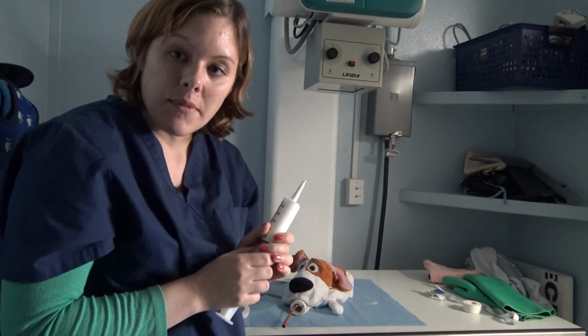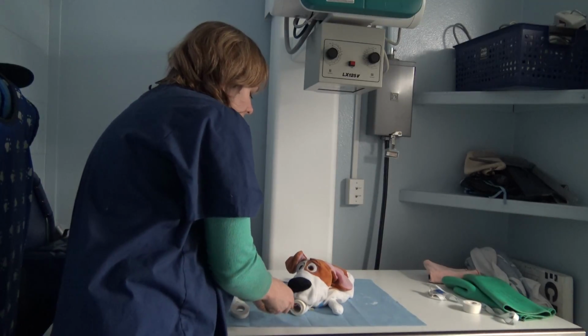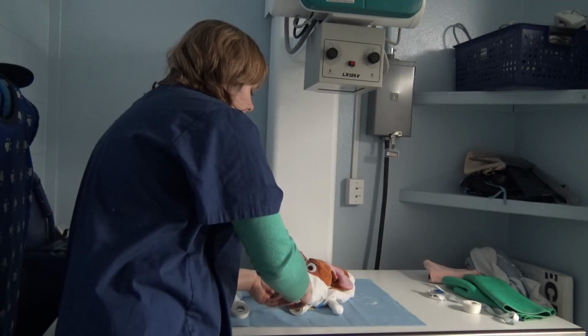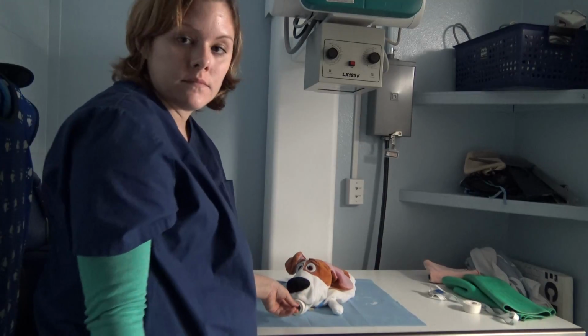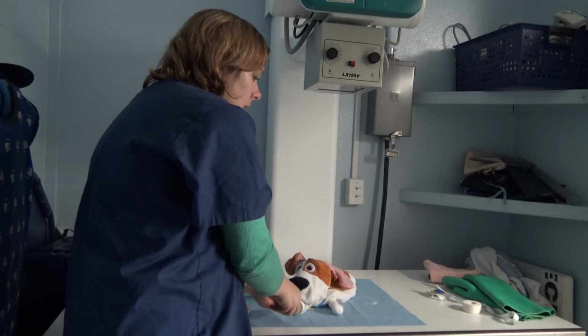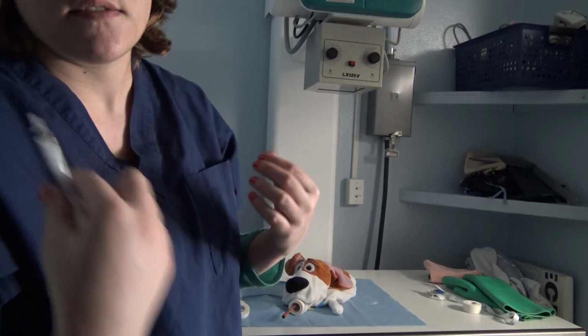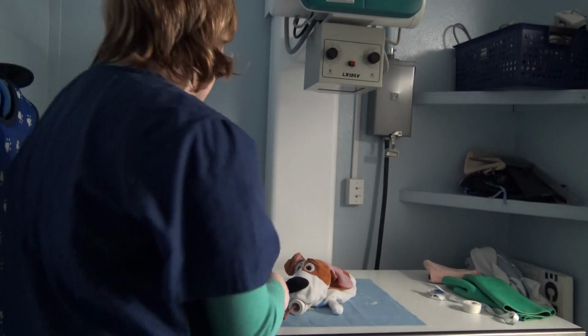So now that our stomach tube is placed, we're going to make sure that it's in the right place by injecting a couple of mils of water. And we didn't hear a cough. Sometimes you can also check with negative pressure and so forth, but typically if you add in a few mils of water, they'll cough if it's in the lungs.